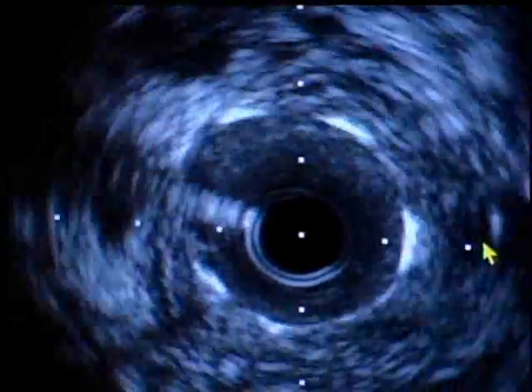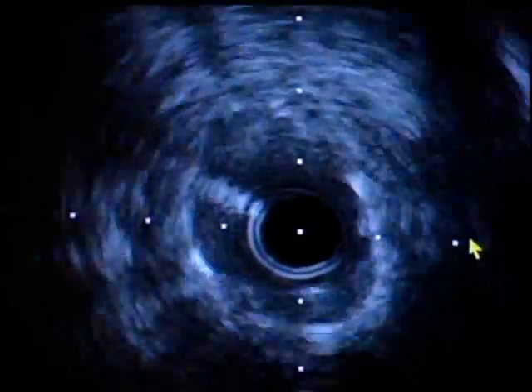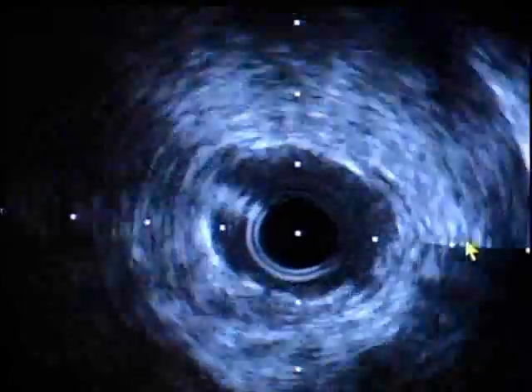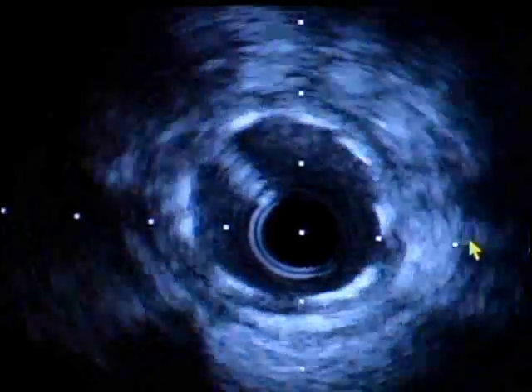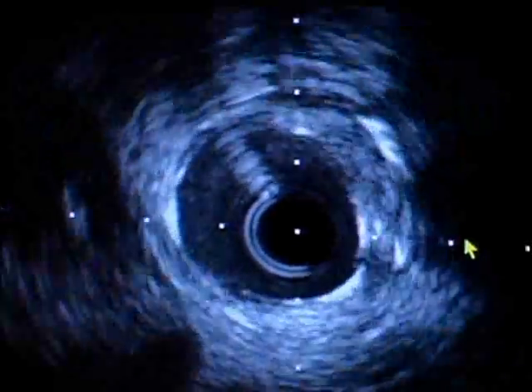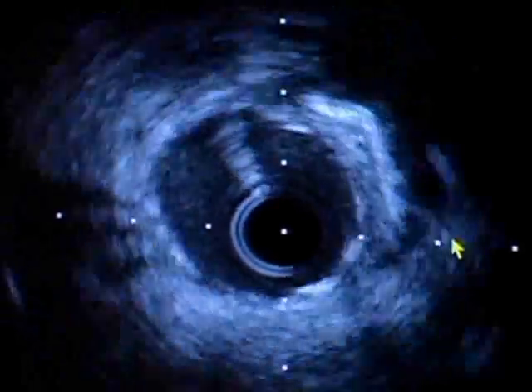Stent, same. There is a lot of plaque. It's apposed to the wall. It's not hanging, but it could use some extra expansion. Probably a 3.0. That 3.0, definitely 20 millimeter. But you see some areas, it's apposed to the vessel wall.